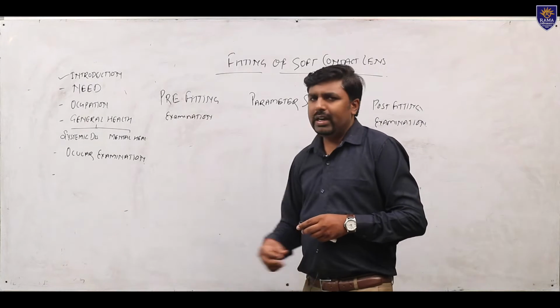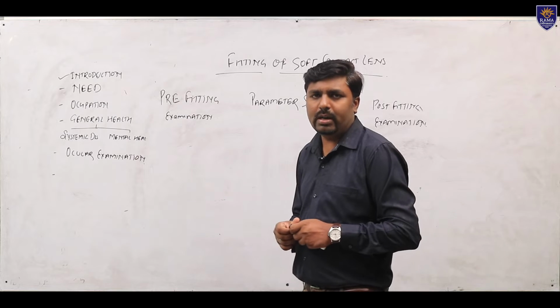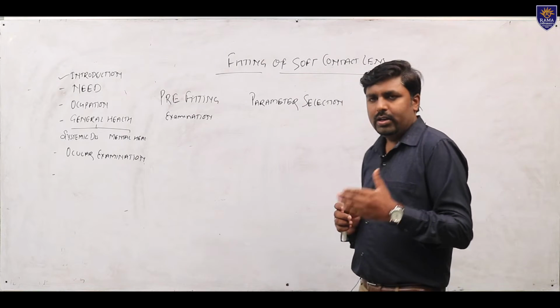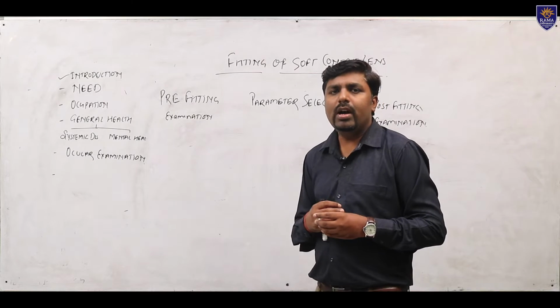Next, what will we examine? We will do the ocular examination. In ocular examination, we assess the patient's eyes for fitting.